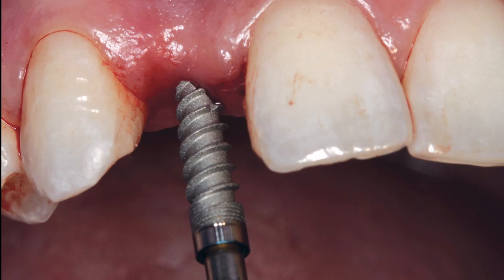A 3.0 millimeter diameter Hahn tapered implant was chosen for this case. The diameter size and tapered body of the implant was ideal for the limited space that was available. Additionally, the implant features prominent threads, which eases placement and allows the clinician to thread the implant into an undersized osteotomy. The ability to place an implant in a slightly smaller osteotomy can help ensure excellent primary stability. This is especially beneficial in cases where bone quality is not optimal.